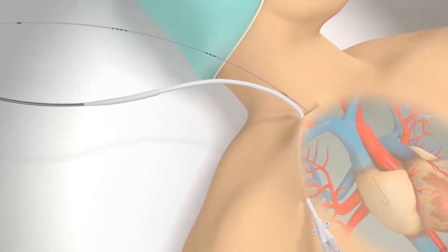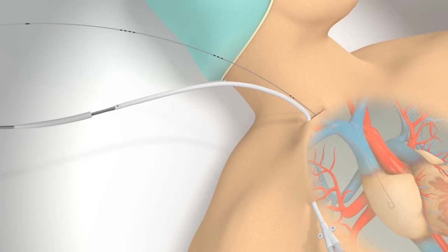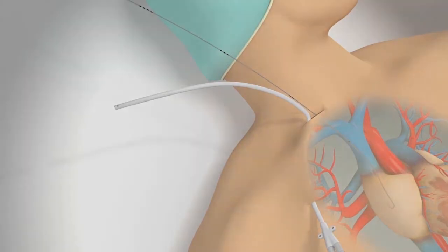Remove the catheter carefully from the tunneling stylet. First, slide the sheath of the tunneler back. Next, grasp the tip of the catheter and gently pull the catheter from the tunneling stylet. Discard the tunneler. If using a micropuncture kit, withdraw the 5 French coaxial dilator, leaving the guide wire in the vein. This is not necessary when using the 18-gauge introducer needle.